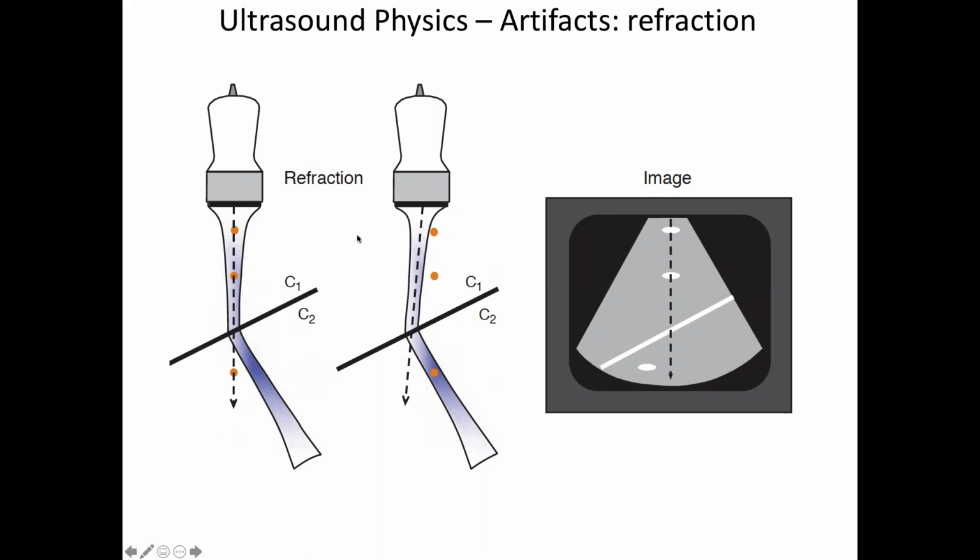So if we look, we've got 3 objects and a boundary in our field of view. When I take this orientation, which is the straight down orientation, and I ask, what does the echo look like beyond the boundary? Well, I don't get an echo from beyond the boundary. It doesn't look like there's anything there.